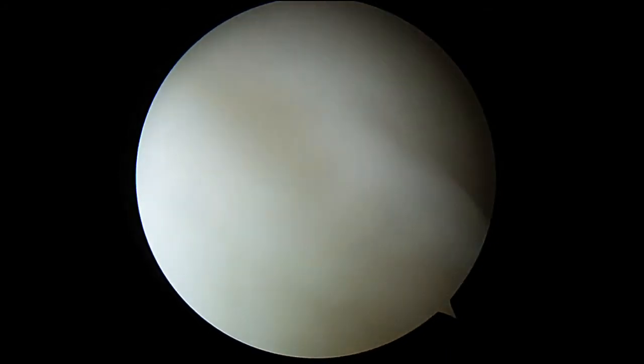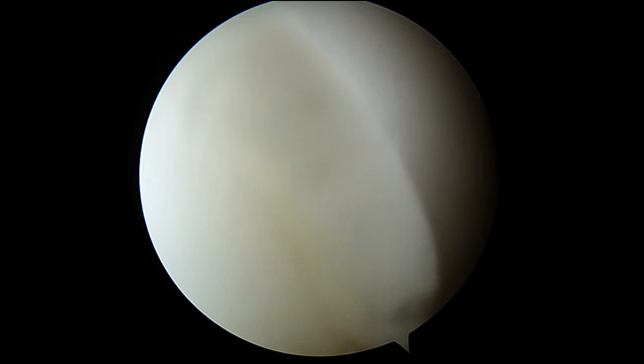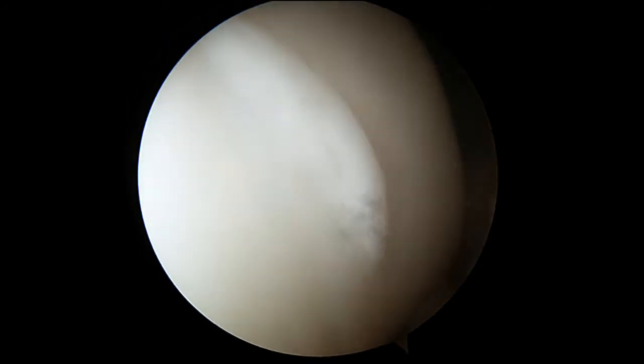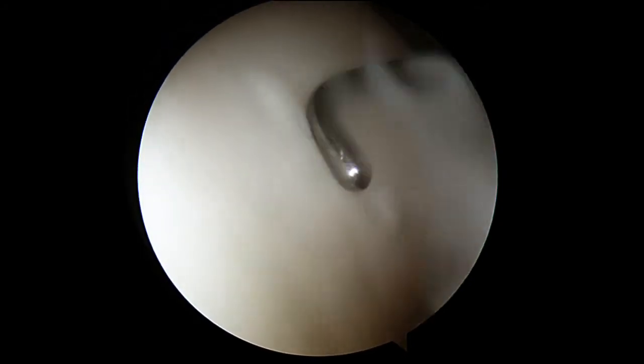It's going to hurt a little bit when you're in sort of a deep squat. Probe please. Pretty small area though — I'm just going to leave that.